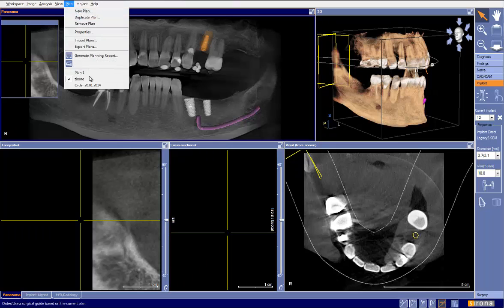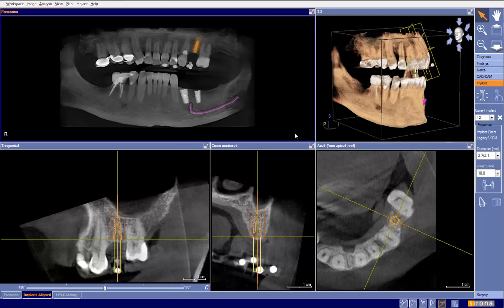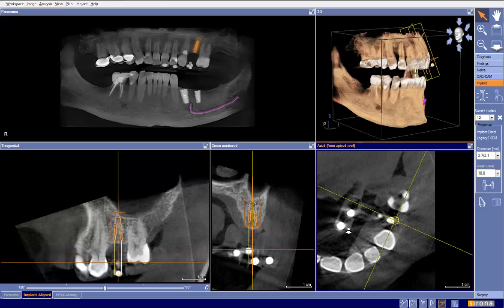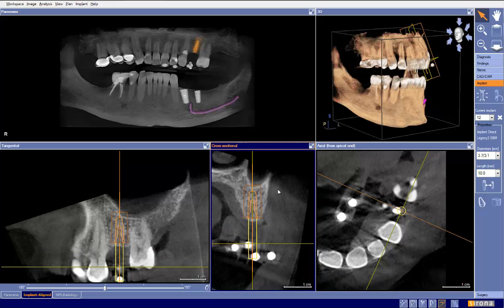The only thing I've done here is I went ahead and duplicated the plan. Again, remember, plan, duplicate plan, and I've renamed it T-bone compared to the original plan, so that way we can compare the original to the finals or the revised plan. So this is a great plan. I think it's a great example of the concept we taught this weekend at our implementation program. So let's take a look and let's go through our checklist.